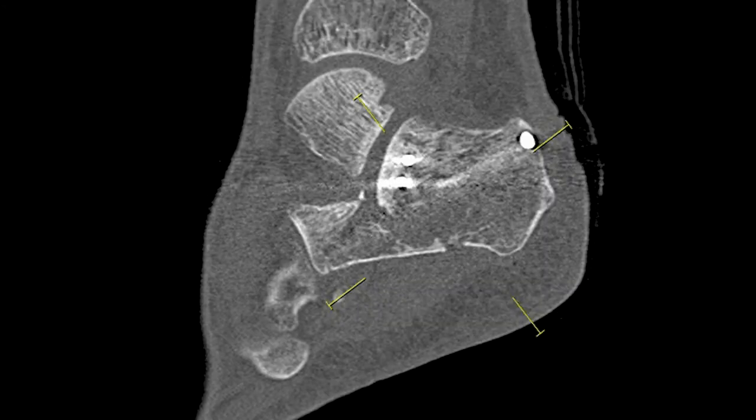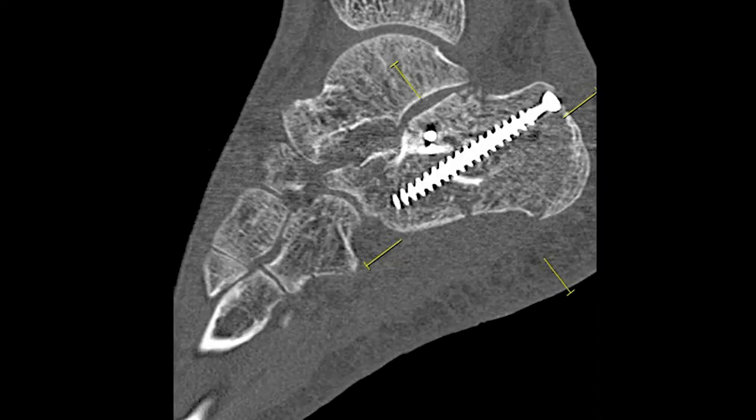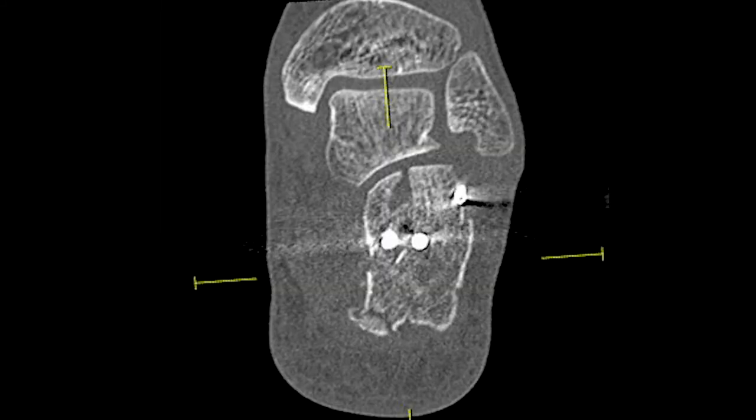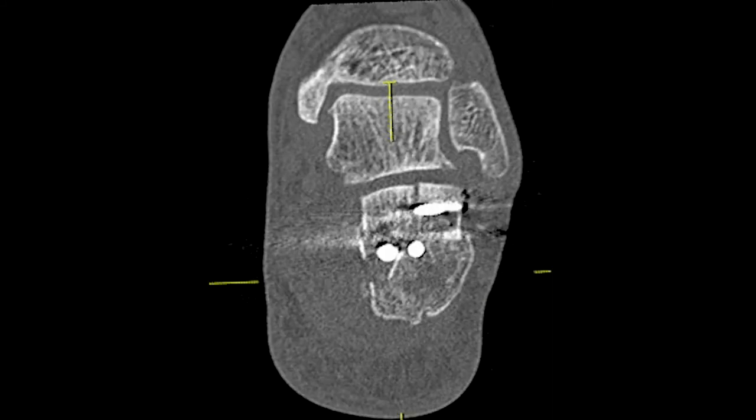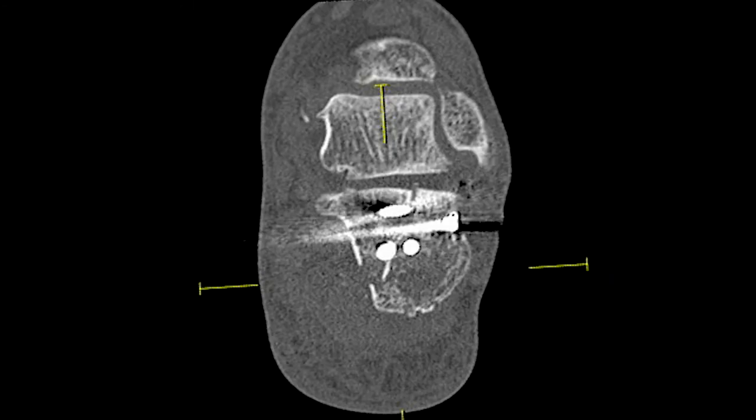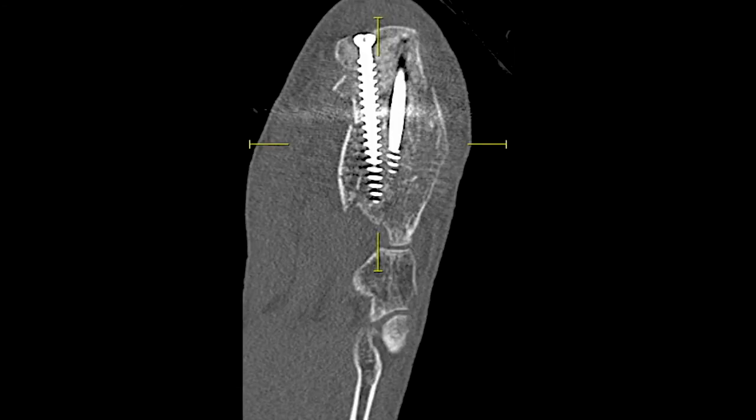Assessing the position of the fragments on postoperative CT, the articular facet is elevated and reduced, and the potential possibility of subfibular impingement is eliminated.